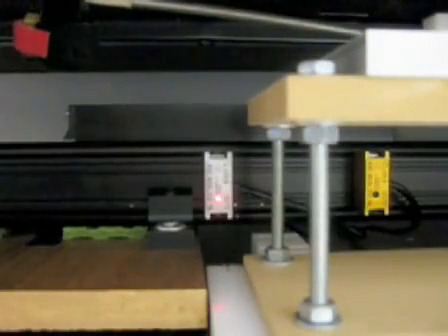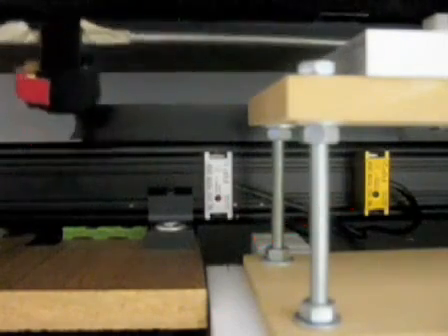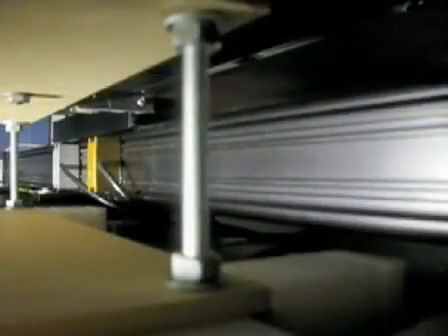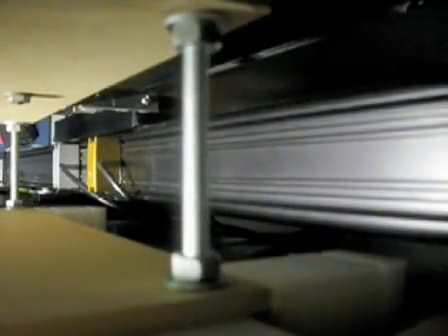As a safety feature, two similar sensors, one of them shown here, set limits to forward and backward movement of the carriage. In the unlikely event of actuator malfunction, these limit sensors disable the actuator, preventing runaway carriage movement.